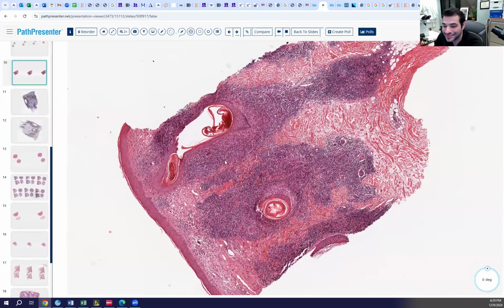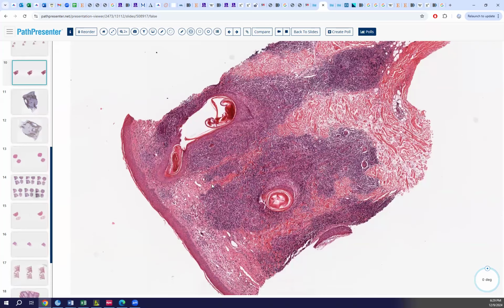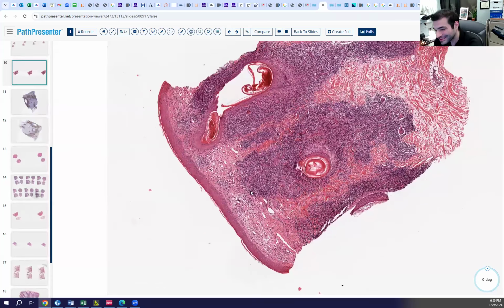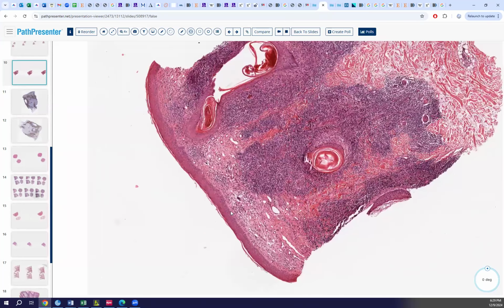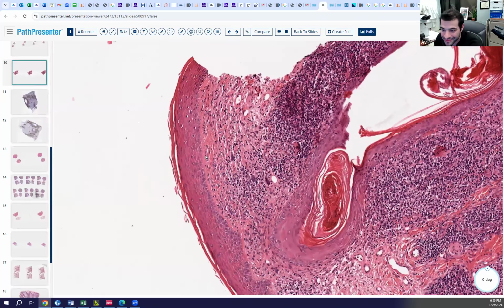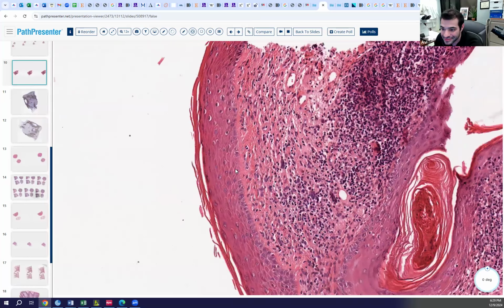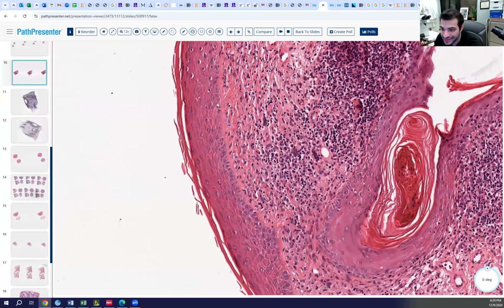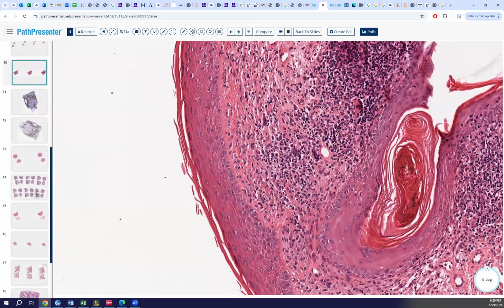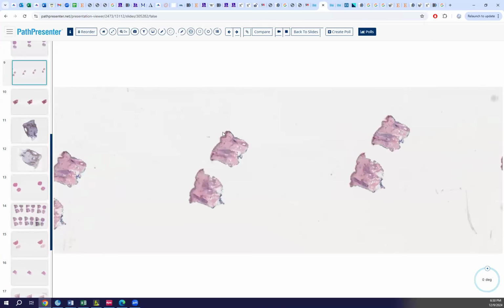And this. More of the same? Well, is it the same? Inflammation and inflammation. Well, first of all, is there an interface dermatitis here, in the epidermis? Yes. Where? So then no. I mean, look.